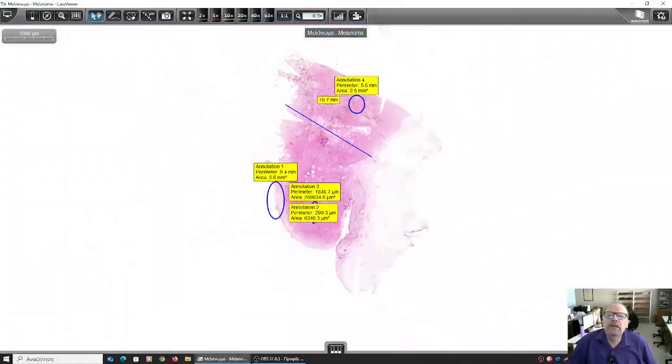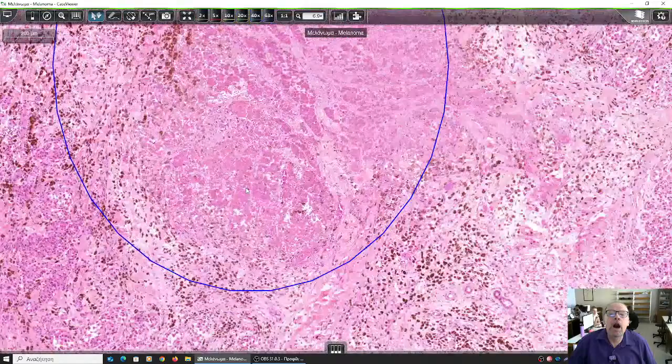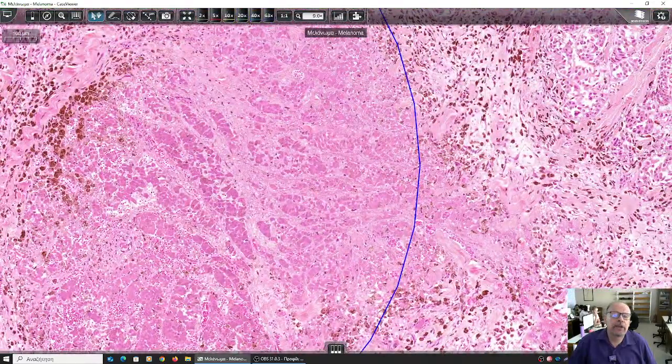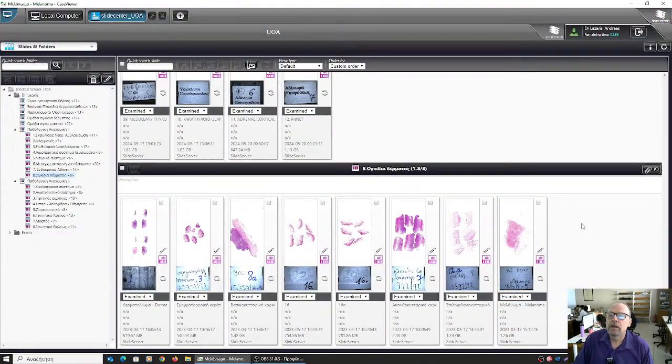Okay. And is there another useful annotation? You see here? These are melanocytes. Are they viable melanocytes? No. This is an area of necrosis as well. Why? What are these? These are the shadows of the pre-existing malignant melanocytes that have now become necrotic. So those were the skin nodules.